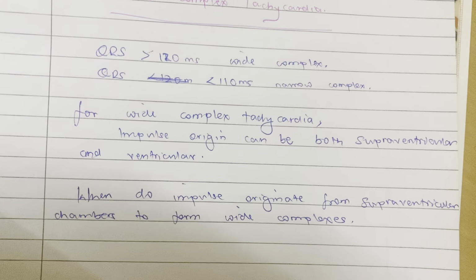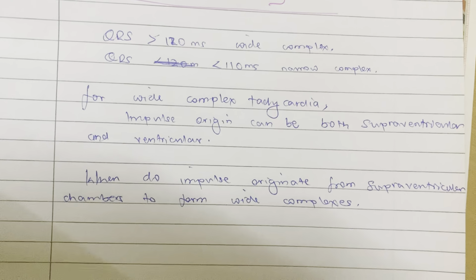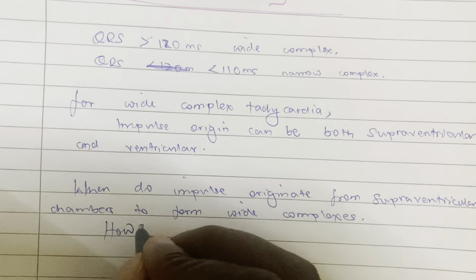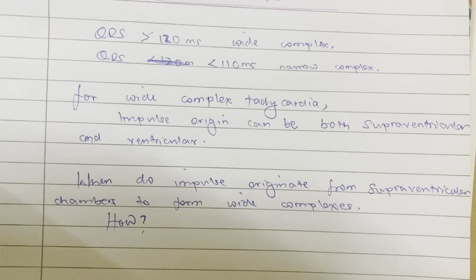How do impulses with a supraventricular origin form wide complexes?